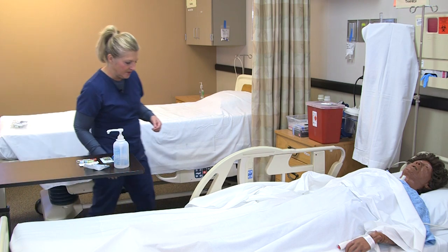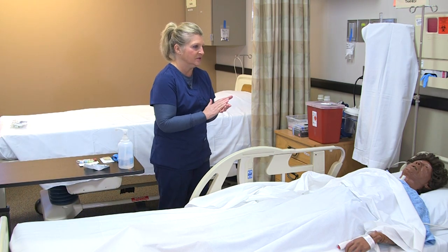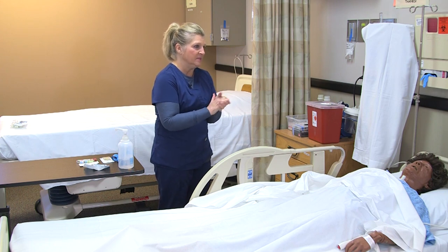I'm entering the room and introducing myself as a student nurse. First, I'm going to wash my hands.